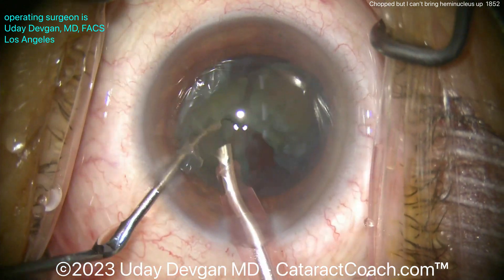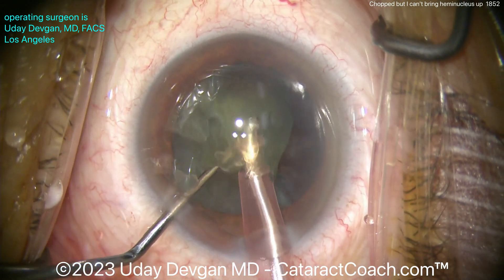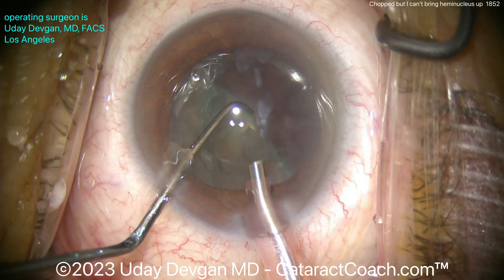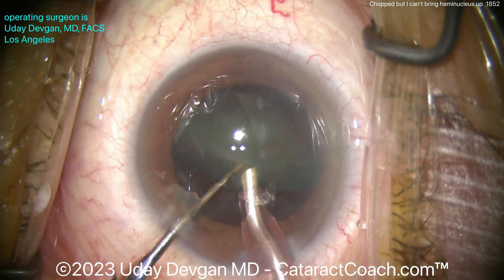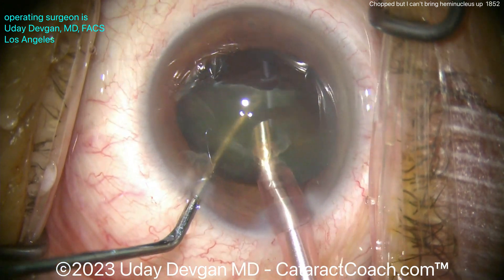It looked like the chop was all the way through, it looked like we propagated the chop completely, but in fact there were still some adhesions between the two halves at the bottom of the chop — the very posterior central aspect of the nucleus. Now it's much easier. One half's already gone; we can just rotate this a little bit, get the other half up, and then of course you can sub-chop it if you need to or just emulsify it — pretty easy.